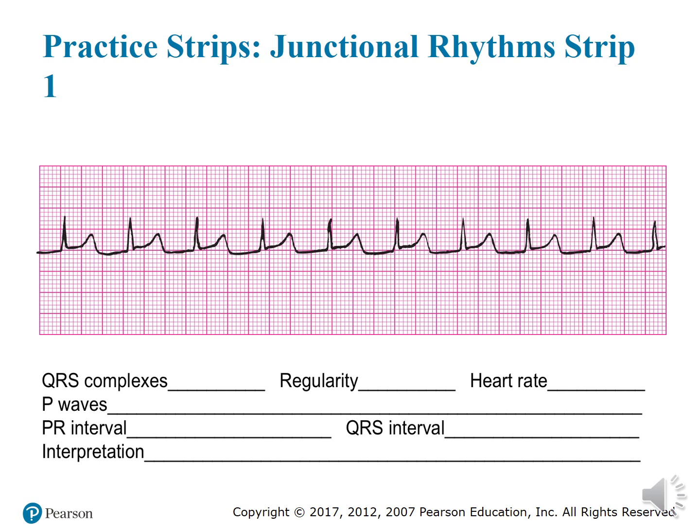So this one will be 1500 divided by 15, which for once I forgot my calculator. Let's do it long form then. I'm going to have to do it freehand. So 1500 divided by 15 is 100 beats per minute. So our heart rate is 100 beats per minute.